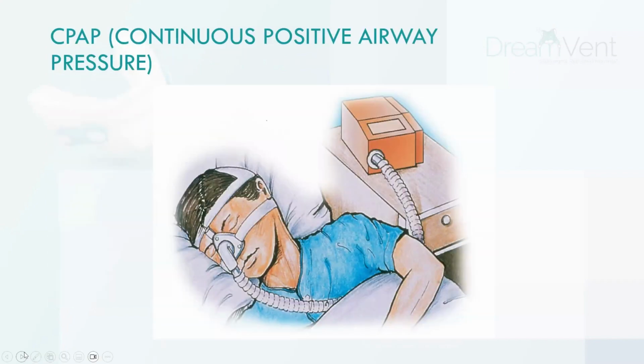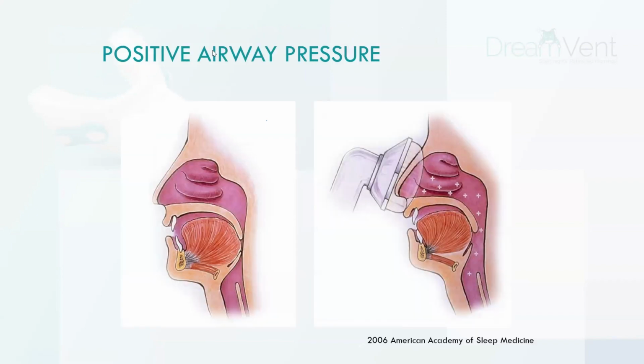But the only two treatments you have are CPAP and oral appliances. So CPAP, Dr. George showed his uncle's machine, and there's the mask, and there's a hose, and the machine is also here. So it is intrusive therapy, but it is life-saving. Compliance is low with CPAP, but it is the best therapy out there, especially for severe sleep apnea.